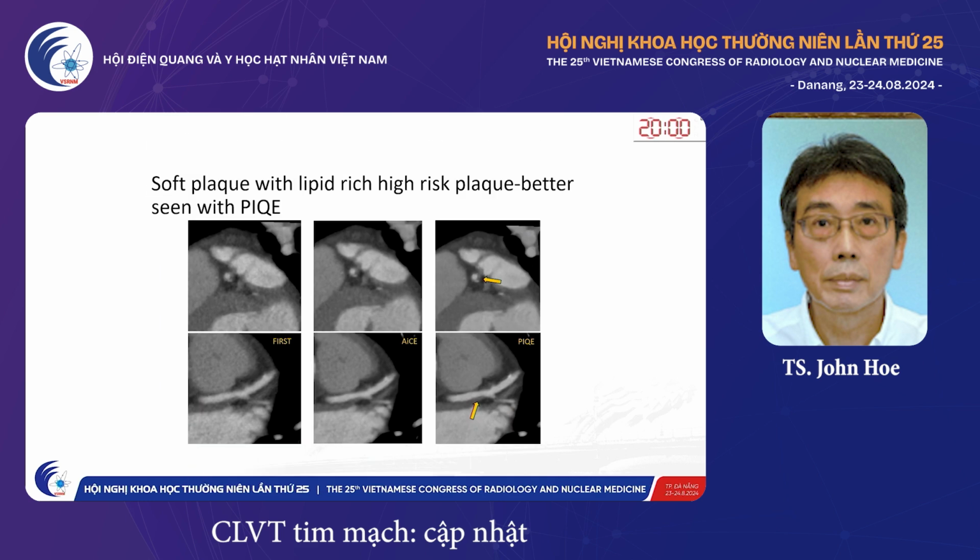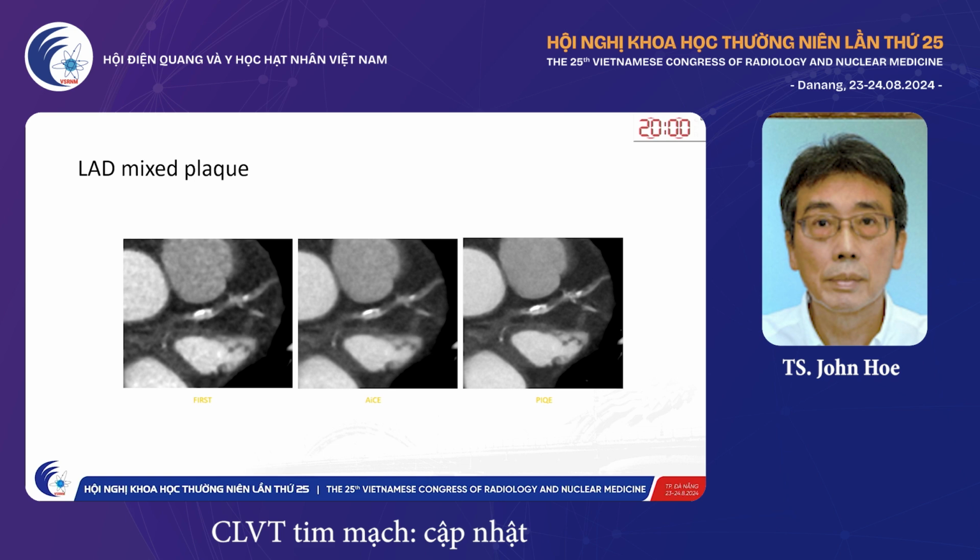Here's an example showing image quality, and you can see with this software, you can see plaques so much clearer than with the software that we were using previously. Here's a mixed plaque. Again, you can see the images are much sharper and there's better definition.